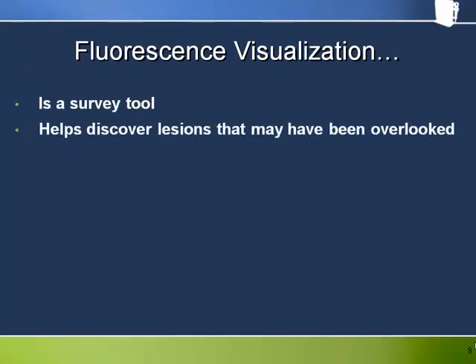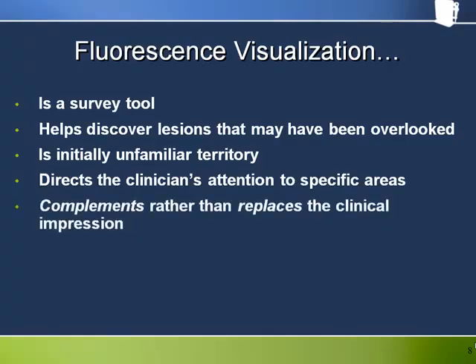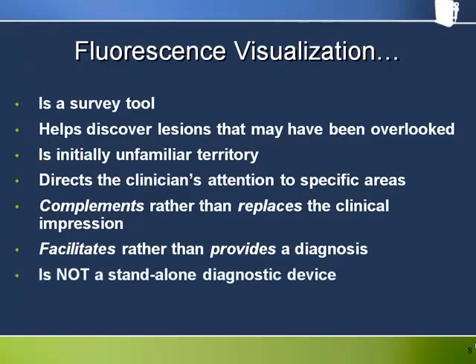To summarize, VELscope is a survey tool that helps discover abnormalities that might otherwise have been overlooked. It is initially unfamiliar territory and thus requires training and experience to fully utilize. It is best used as a survey tool that directs the clinician's attention to specific areas. And it's another means to visualize the disease process that complements rather than replaces the clinical impression. It facilitates rather than provides a diagnosis. And it is most definitely not a standalone diagnostic device.